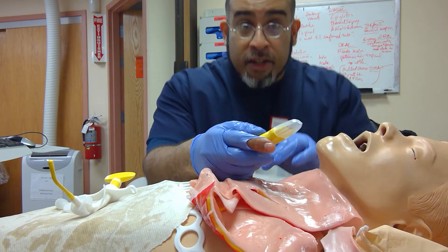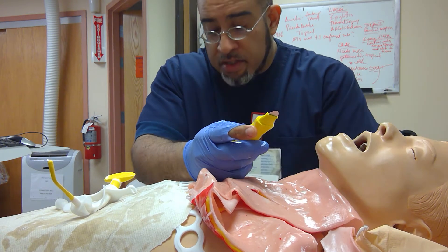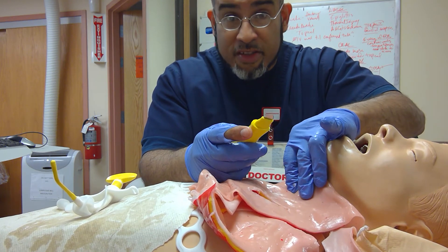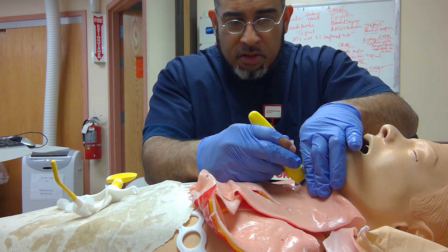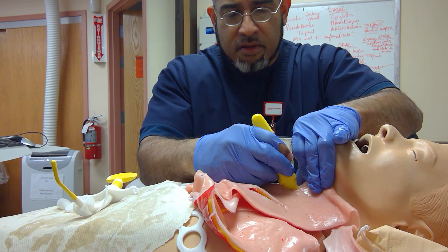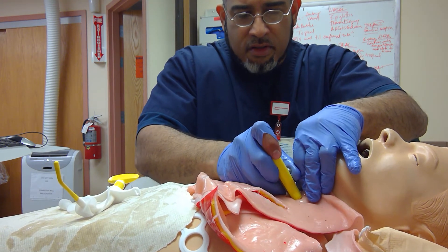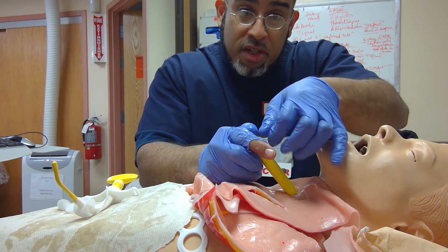Feel my landmarks. I'll hold my right hand down in case I get the nervous Nellies. Made a decision to make a surgical airway for whatever reason. I feel a divot — I feel what could be the thyroid cartilage, with thick skin in between. So I commit to a vertical cut. Start feeling around. I think I feel the horizontal. Put a stab — stab it horizontally. I push forward.